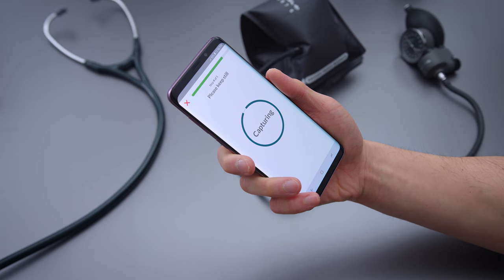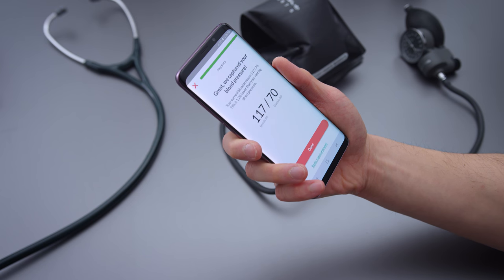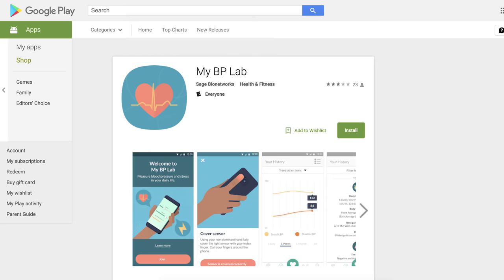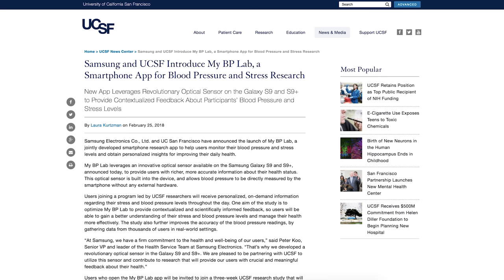So I wanted to see what this thing could do — if the sensor was accurate and worked like I thought it would. There are some good things and some bad things, so we're just going to go through them. To make this work, you need to get an app specific to the S9 and the S9 Plus. It doesn't work on other phones. It's called My BP Lab, and it's made in conjunction with Samsung through some university — the only app that currently uses the blood pressure sensor.